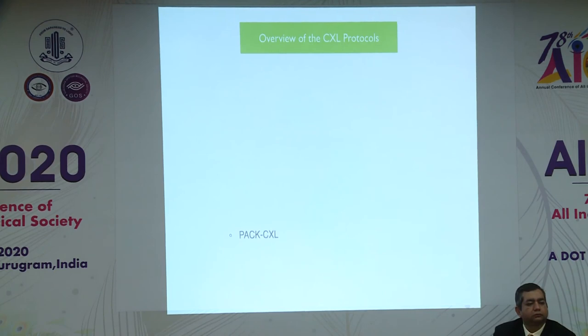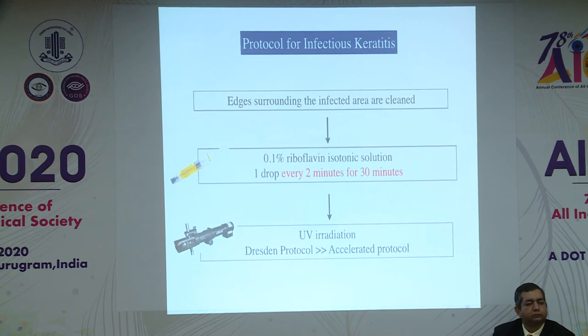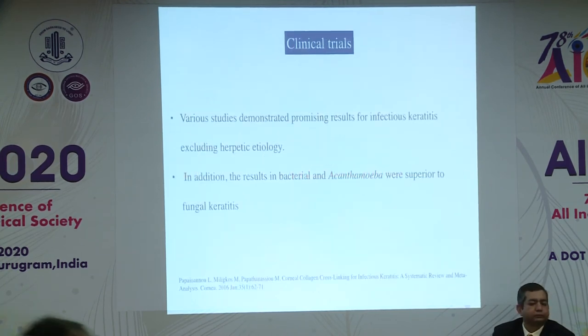And lastly, PACK-CXL, it stands for photoactivated chromophore for infectious keratitis. So it has been shown that when riboflavin and UV irradiation are combined, it kills microbes, it also arrests stromal melting and reduces inflammation. We can use either Dresden protocol or accelerated protocol, but the important thing is to clean the edges around the infected area and freshen up the epithelium and then do the cross-linking. And various studies have shown that it acts better in bacteria and acanthamoeba, but not so much in fungal keratitis, but there are few studies which are still happening.